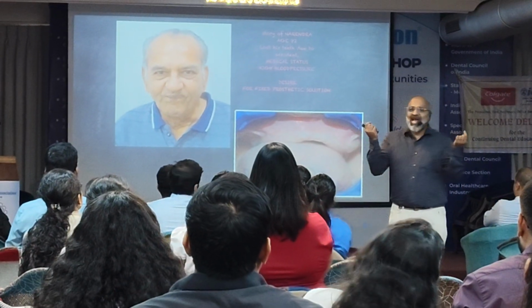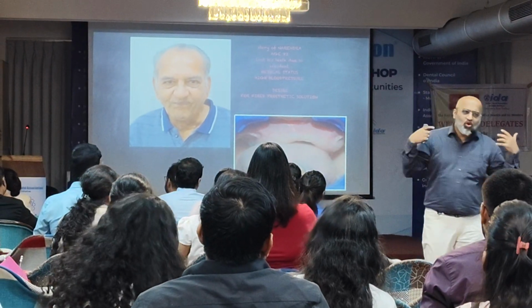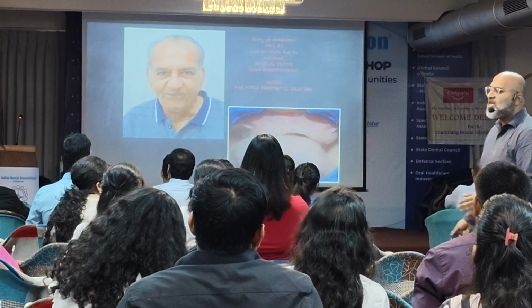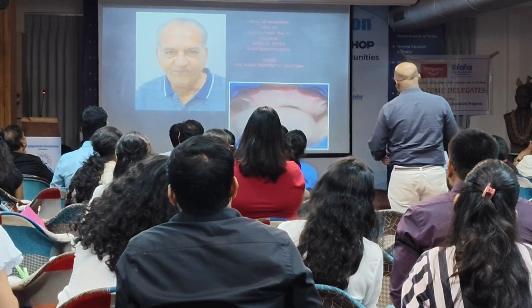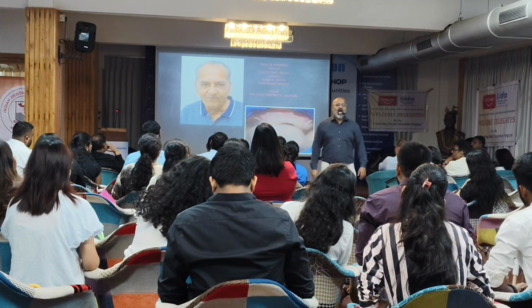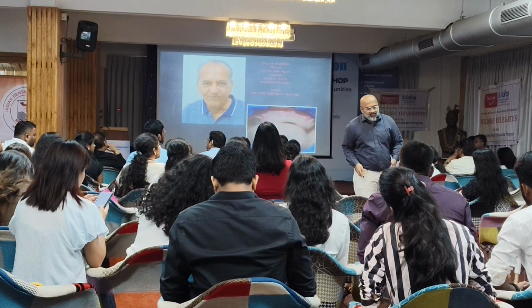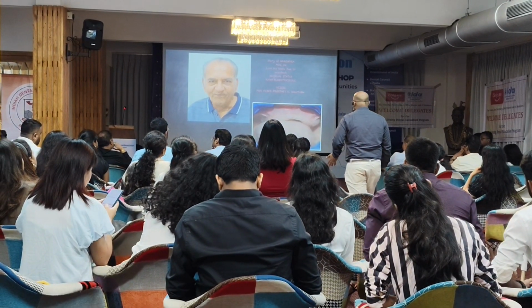So there used to be two metallic rings and there used to be a bridge, which are also very lovely. Means they have stood the test of time. I mean, he had it done in the 80s, and I removed it maybe 10 years back. So what happened in this situation was this case was medically compromised. I had to be as sure and as safe as possible when I was doing this case.